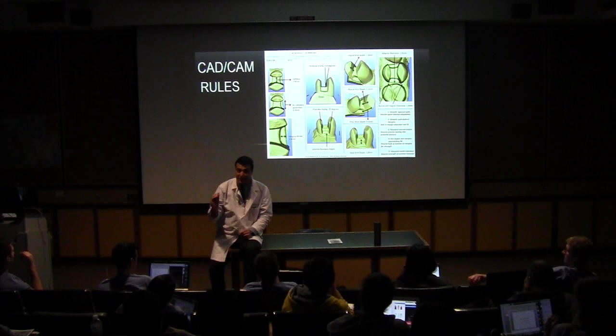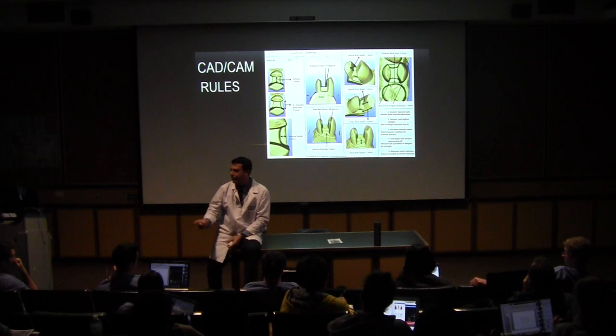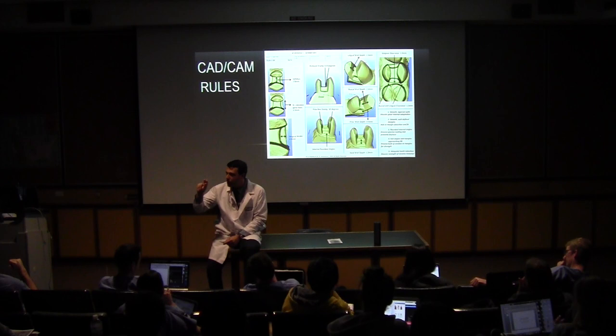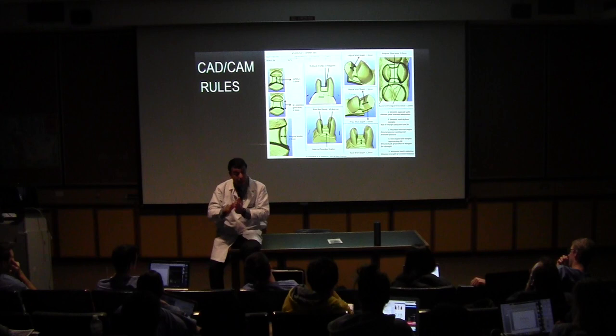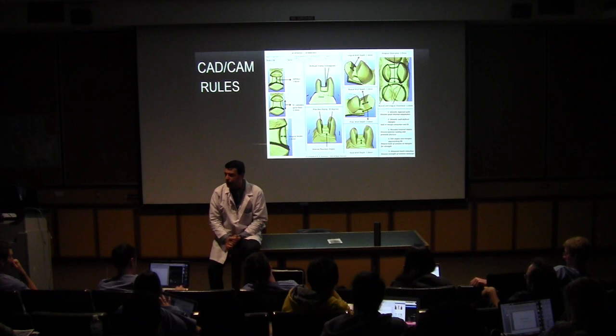But anyway, what is the second most important rule? Enough room. Adequate reduction. If you don't have enough reduction, forget it. Remember, with reduction we are working with one specific property of the material you're putting on the tooth: resistance. If you don't have enough reduction, the lab technician might say, who cares what the doctor is asking, I'm checking the articulator here, and send this onlay back with less than 1 millimeter thickness of occlusal ceramic. Do you think that's going to last? Why not?